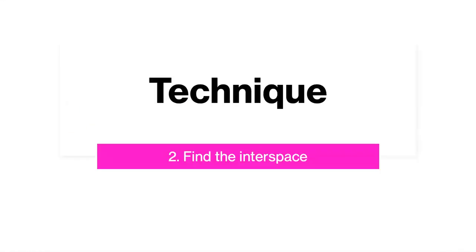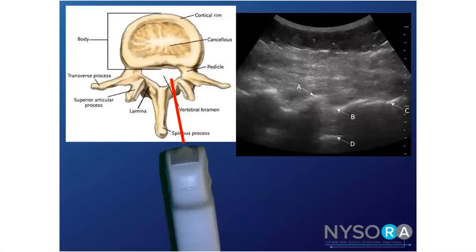So secondly, one needs to identify the interspace or the interspinous space. And this is achieved by now orientating your probe in the longitudinal axis. Okay, previously we were transverse, now in the longitudinal axis, and slightly off the midline and with the inward tilt, targeting the window that's created by the lamina. And this is the picture that one achieves.